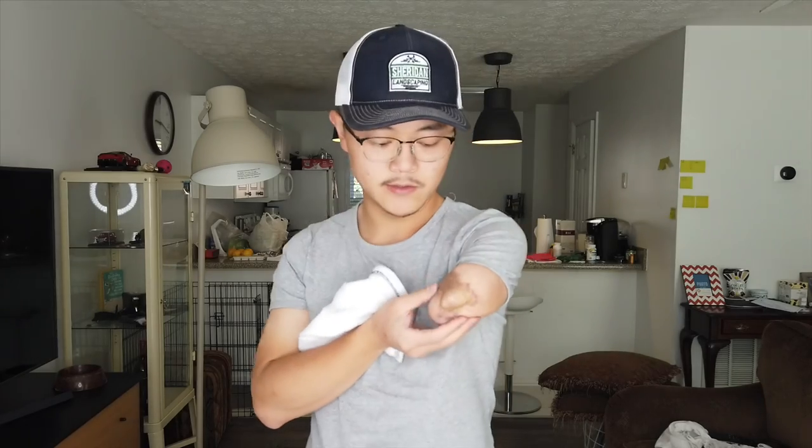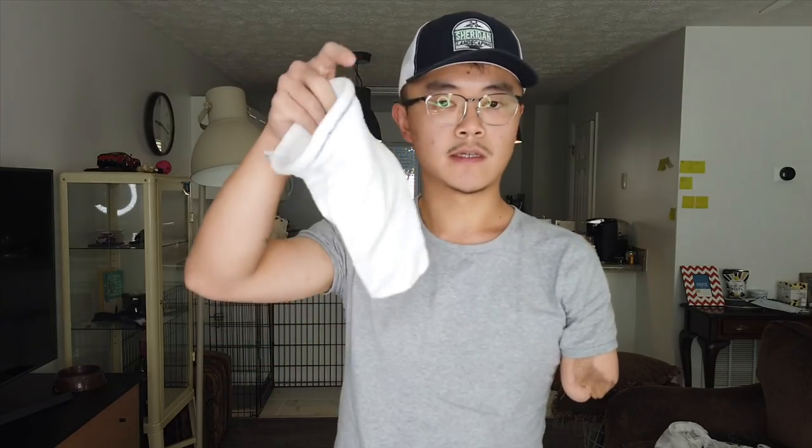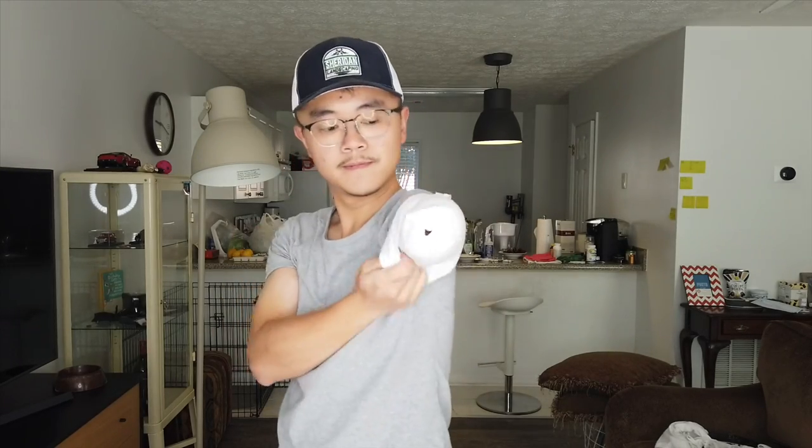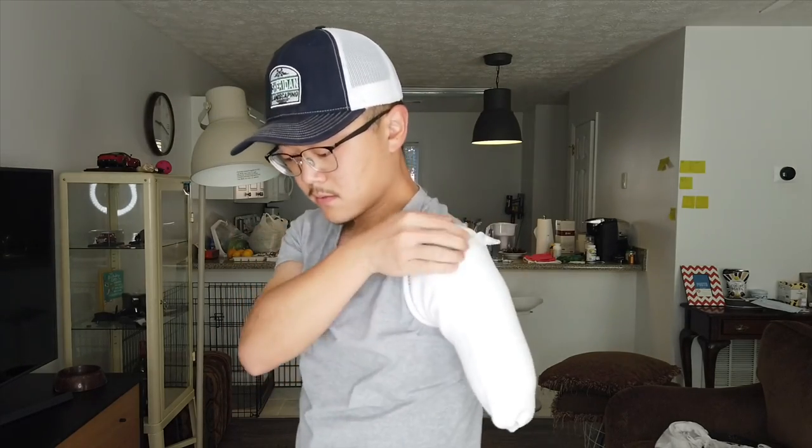As I mentioned earlier, because my residual limb has shrunk over time, my socket is a little bit bigger than it should be. So I use a sock here — it's a little thicker. I can wear it on my limb and that makes it fit a little bit tighter. So I put on the sock.